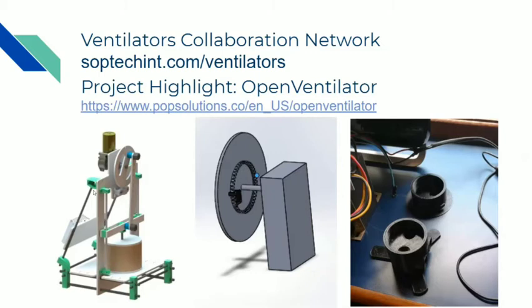So here in the middle is the motor and the encoder. As you can see, this is for the Mark II version. And again, I will repeat, the Mark II version is for people who have resources to build it. The Mark I will be able to sustain a patient on level 3 of COVID-19, but not a patient on level 4. A patient on level 4 is almost dying.